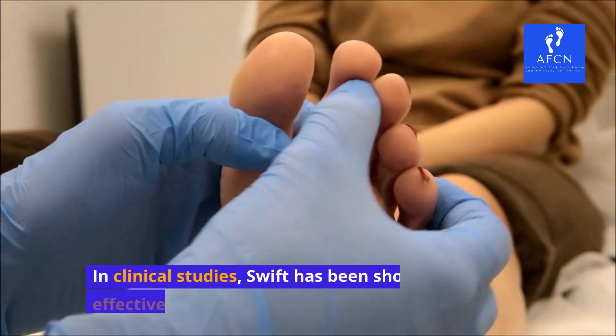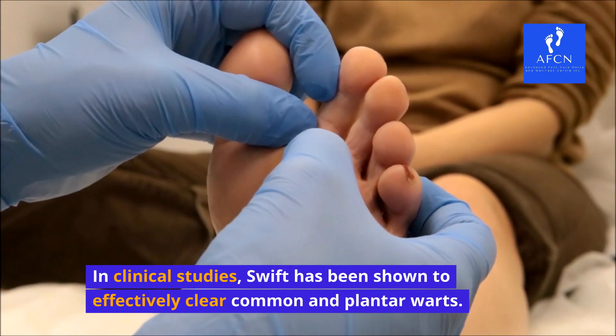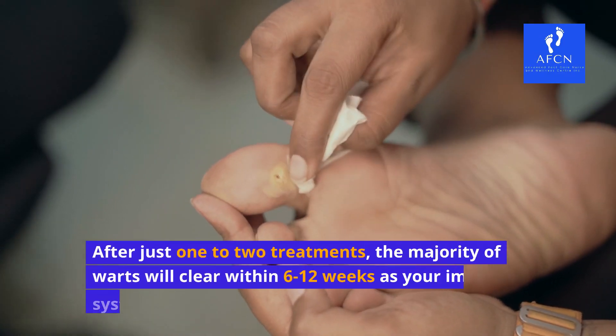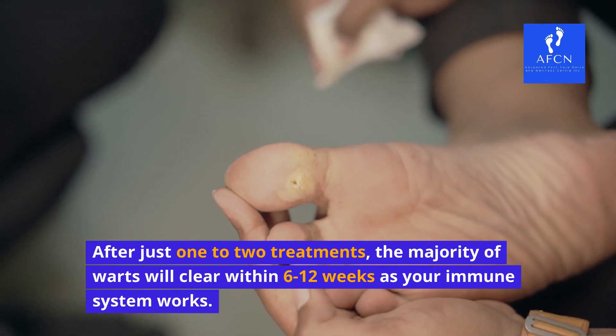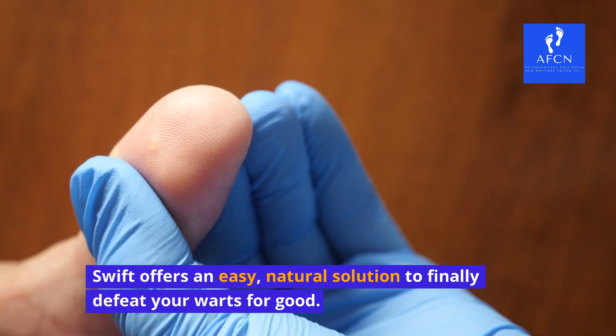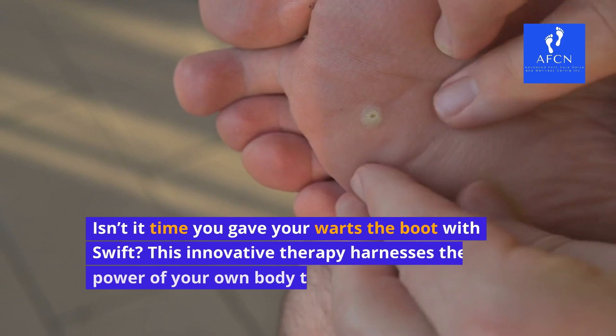Proven results. In clinical studies, Swift has been shown to effectively clear common and plantar warts. After just one to two treatments, the majority of warts will clear within 6 to 12 weeks as your immune system works. Swift offers an easy, natural solution to finally defeat your warts for good.